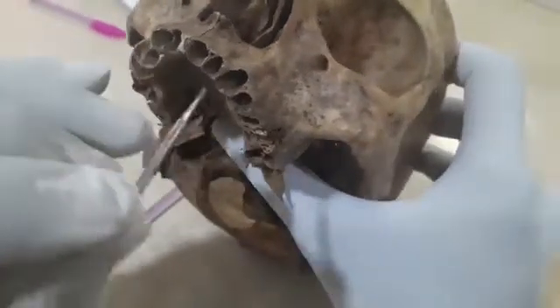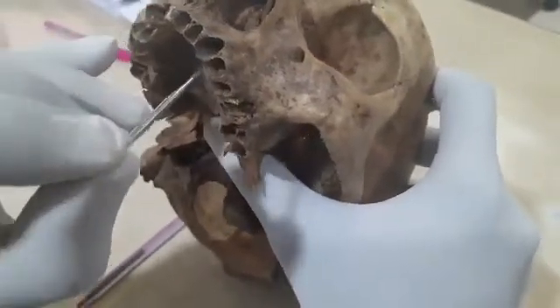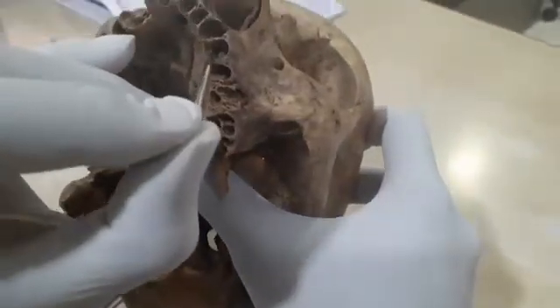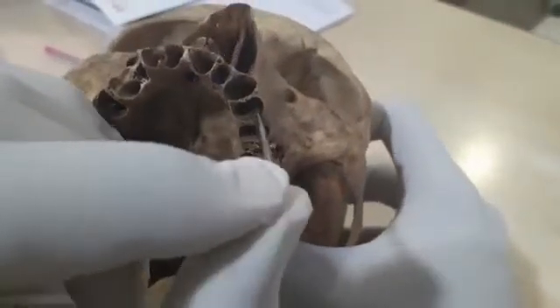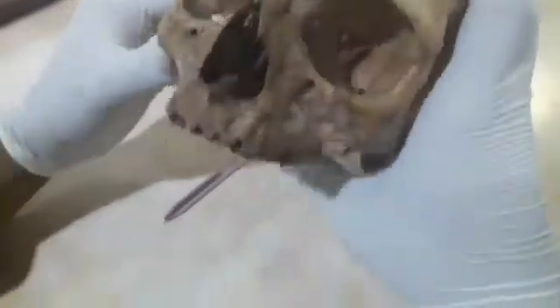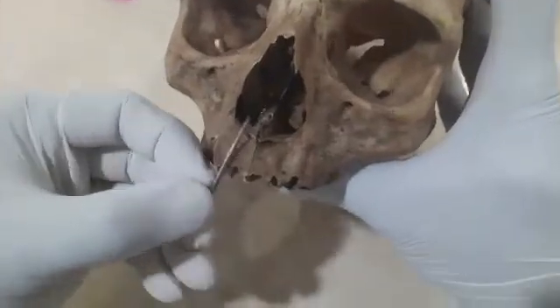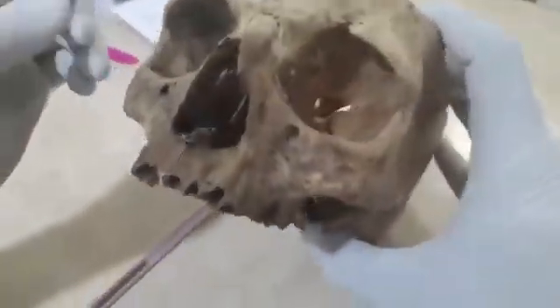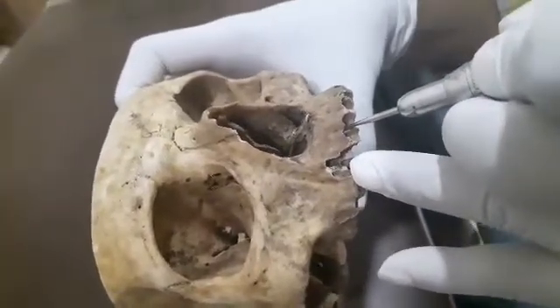You have to engage the floor of the nose, and you have to go slightly medially. The angulation will change here — you have to go medially. This should be the angulation: medially and anteriorly. So this should be your angulation. We are going slightly palatally.